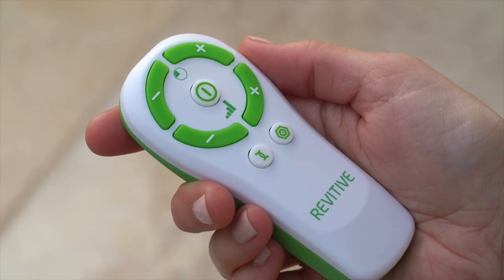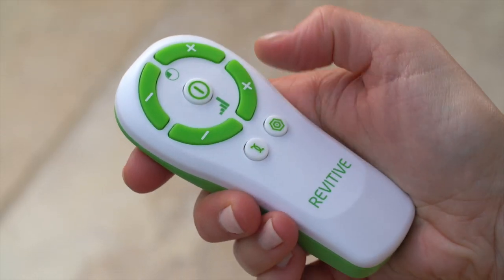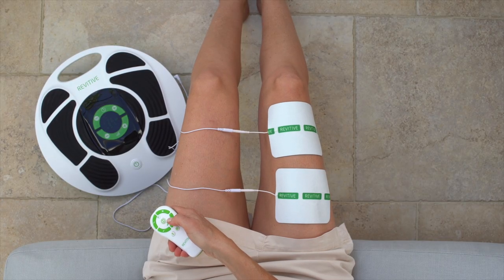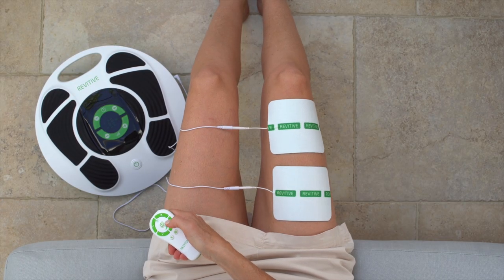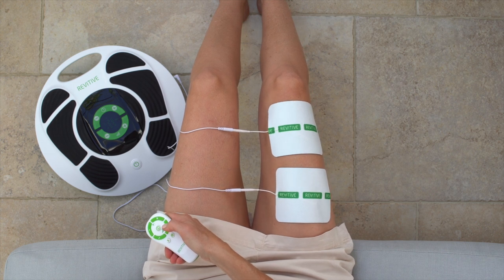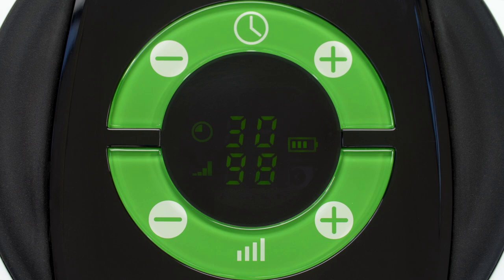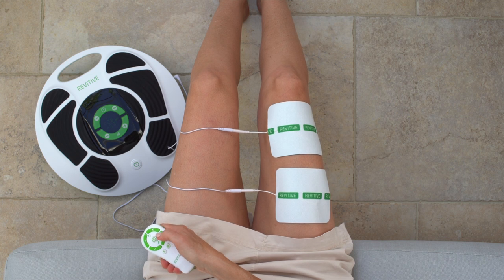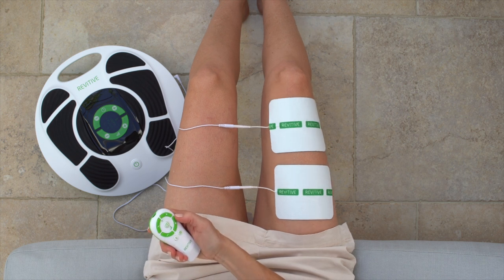Using the remote control, turn on the device and start increasing the intensity level. The therapy starts with 30 seconds of stimulation to help you find the right intensity level, followed by a rest period of 30 seconds with no stimulation. The intensity level goes from 1 up to 99, and you want to find your highest tolerable intensity level where you get a very strong muscle contraction.